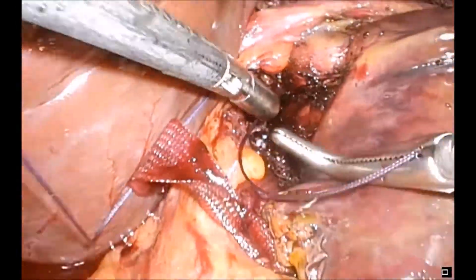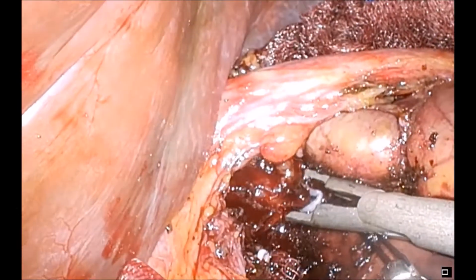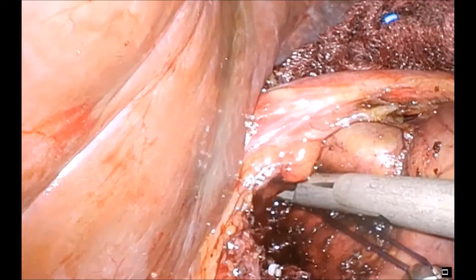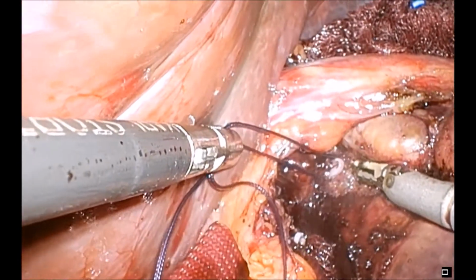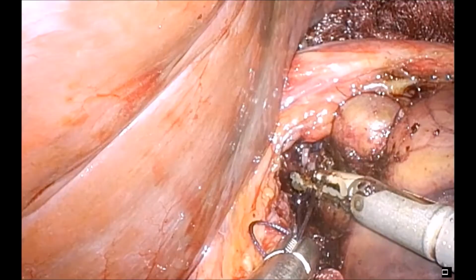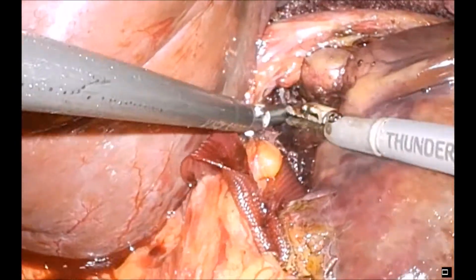A small vessel is controlled, ties placed around it, and this facilitates the placement of a hemalock clip. There we go. And then the other side, because there's not much room, is taken with the Thunderbeat, sealing it off nicely.